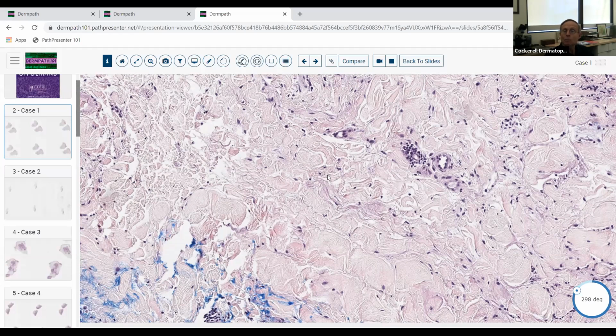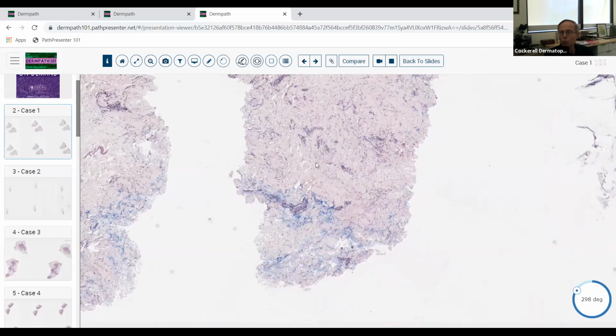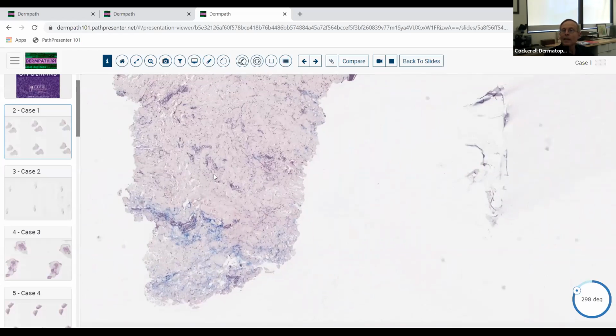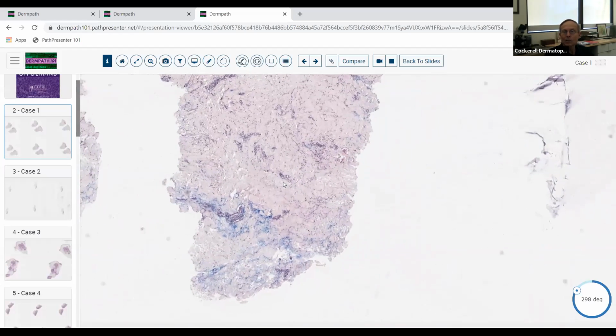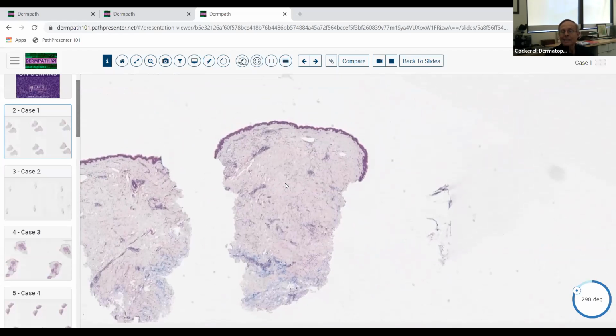If they're lymphocytes, plasma cells, and then eosinophils, and then of course with this collagen change, you can think about the inflammatory stage of morphea. Now, one other point about morphea. If you get it really early, even earlier than this, and we don't really have any subcutaneous fat here because this was probably a fairly thick sclerotic plaque that was biopsied.